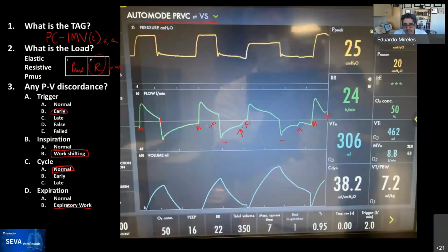There's a question if this is a missed trigger over here. Yes, Ryan, that could potentially be evidence of effort or relaxation. So good eye.